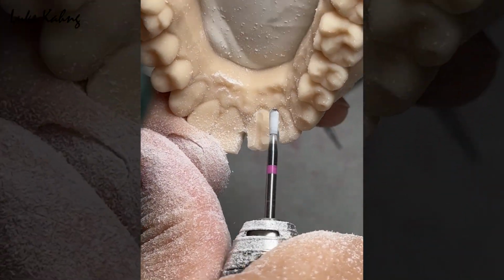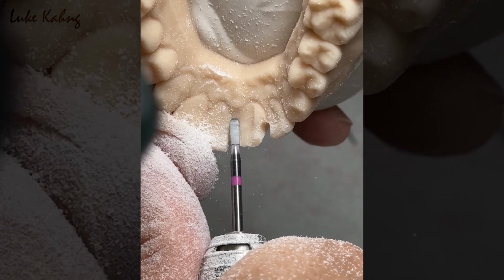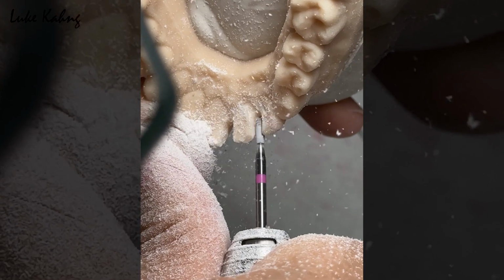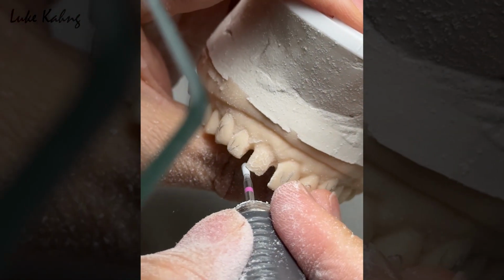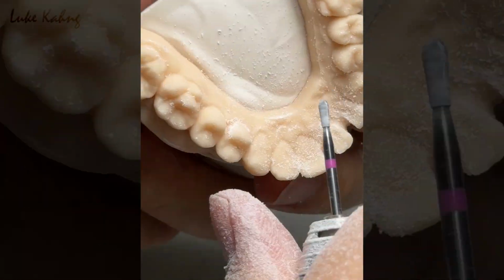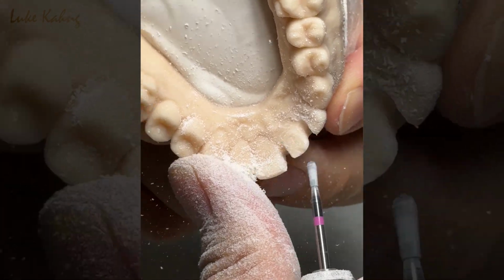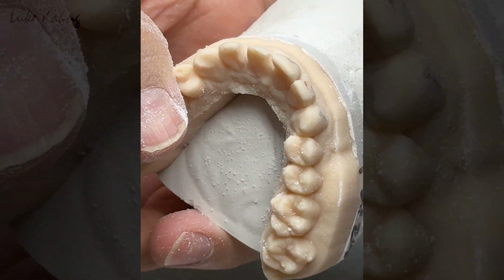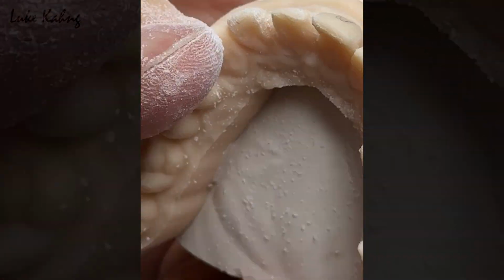Same thing, the lingual. And the 1 millimeter reduction at least, so they can get a good prep. See? Okay, just a little bit more. That's it. That's a good crown prep.